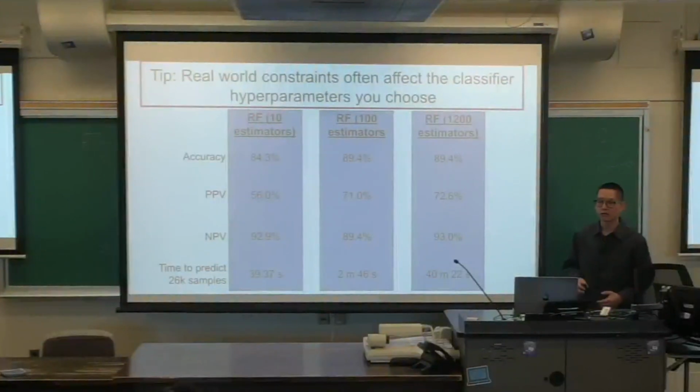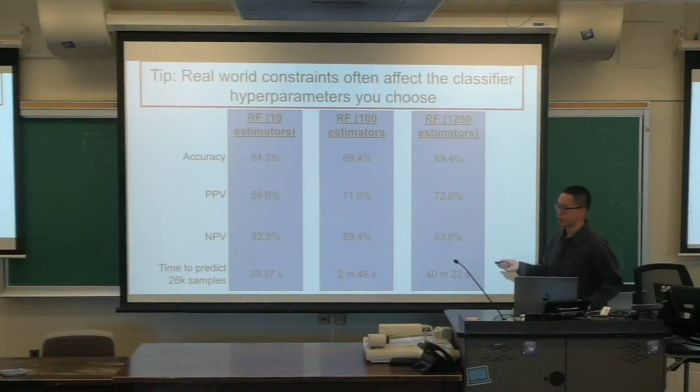Yeah, question? What was the size of the training set? Right, I forgot to say. When we were collecting the data, it's around 5 to 10 minutes of EMG signals from the patient, and I think that's 50K data samples, which is still small compared to vision or language. Cool. Good question.